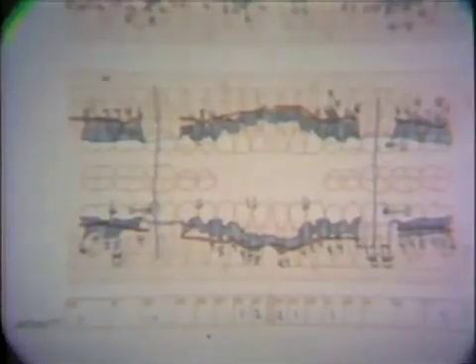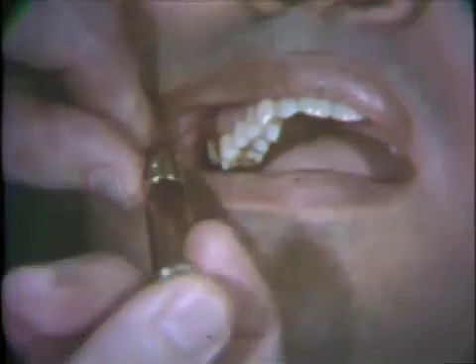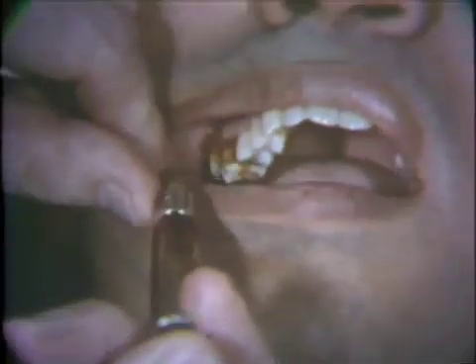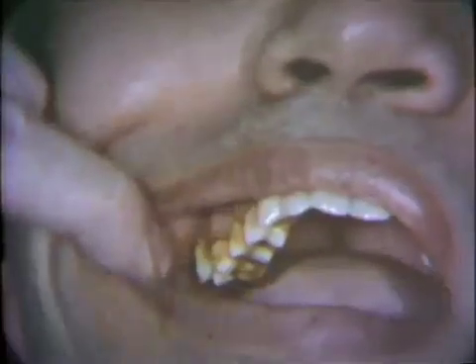The free gingival margin is related to the cementoenamel junction, and the area between the free gingival margin and the bottom of the crevice or pocket is marked in blue. The field of operation is flooded with iodine lotion, which is also deposited in the periodontal pockets with a blunt needle syringe. Excess iodine is absorbed with the sponge.